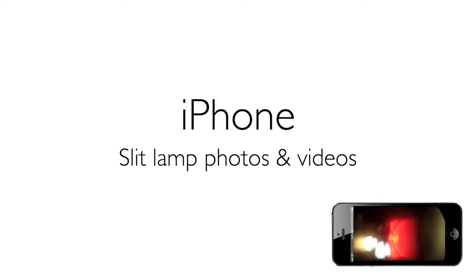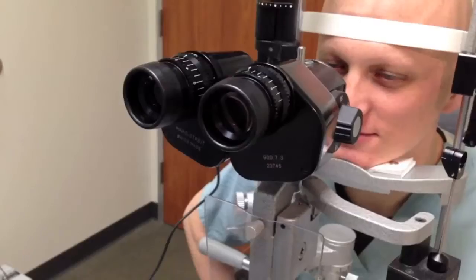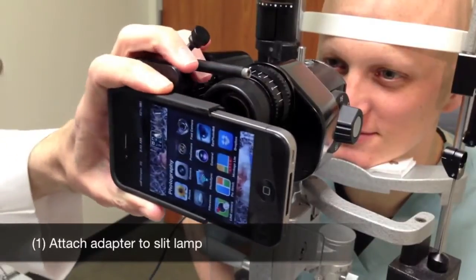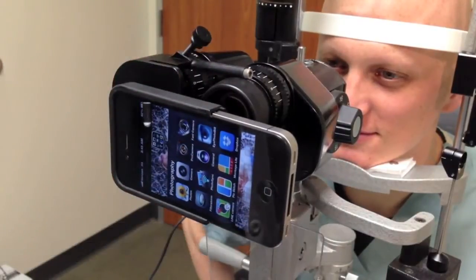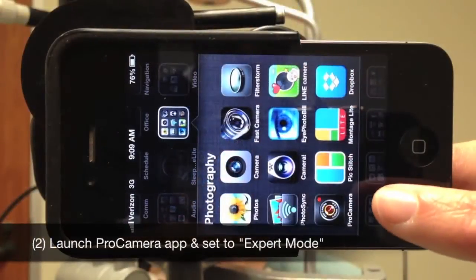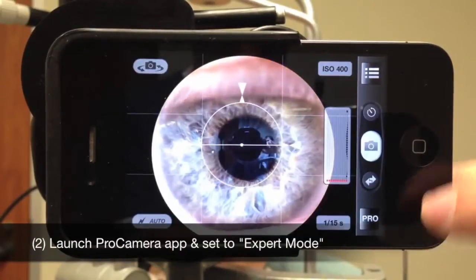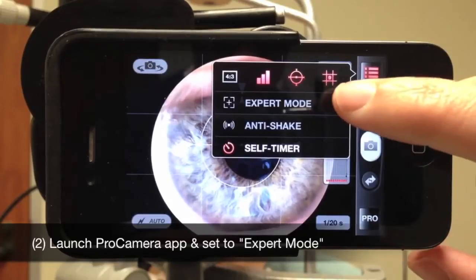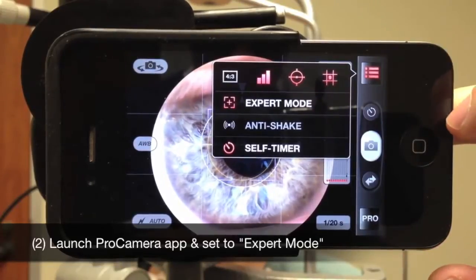Here's how to record slit lamp photos and videos with the iPhone. First, attach the adapter to the slit lamp. Next, launch the Pro Camera app and be sure to set it to expert mode to permit independent control of exposure and focus.